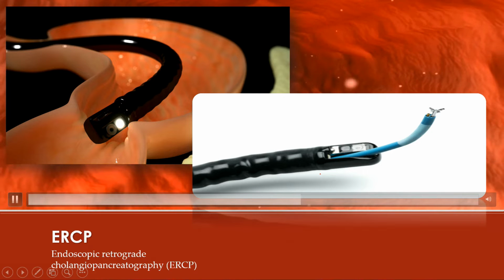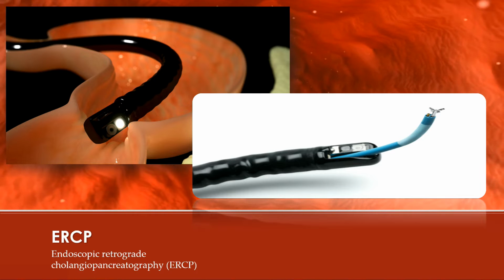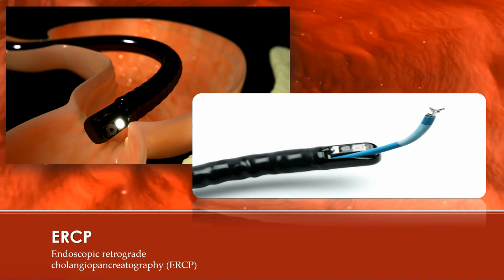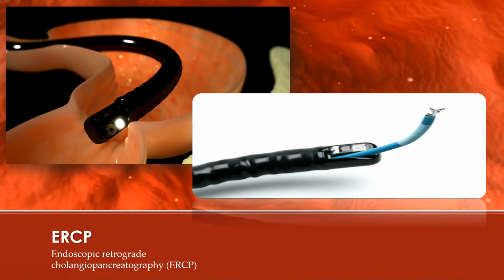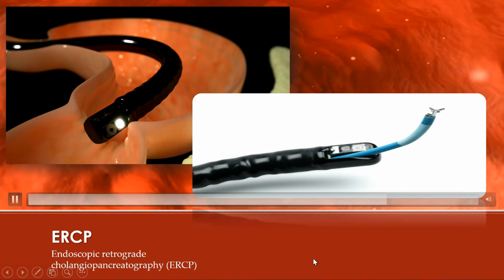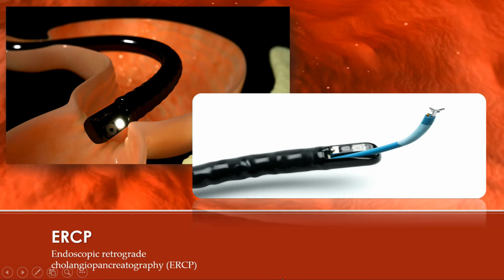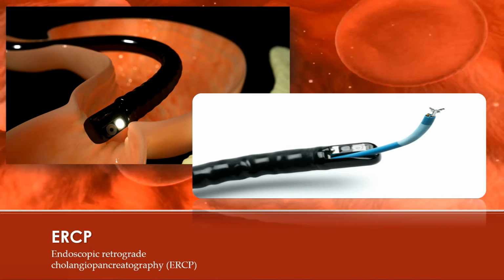So through the endoscope, you can put a choledocoscope, and then you can enter into the CBD. And nowadays you have ultrasonic lithotripters. Sometimes there is an incarcerated stone; we can break those incarcerated stones and we can suck them out. But of course, this is expensive technology, and this micro part of the endoscope is very fragile. After a few procedures, it breaks. So that is why still in developing countries, conventional ERCP is going on, where we use a C-arm and perform ERCP under fluoroscopy.